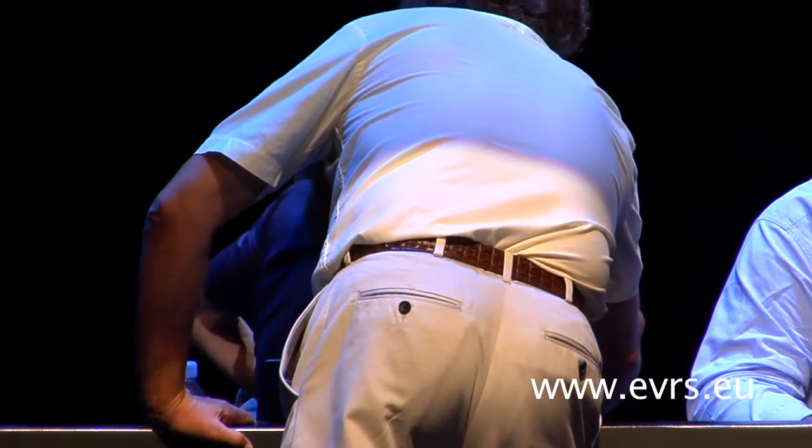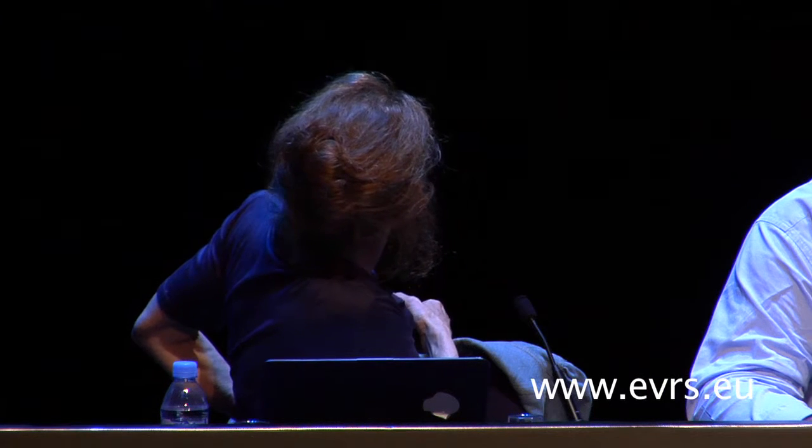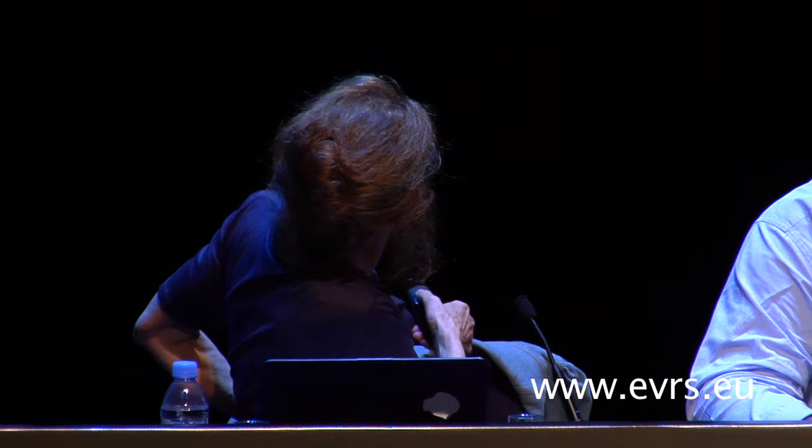Okay. Good afternoon. You know the principle of the flow control vitrectomy, which is that the pump self-adapts the vacuum to generate a constant flow independently of the variations of viscosity. For the sake of the understanding from many previous meetings, people told me that with the overlay on the screen of the console, it's a fantastic way to understand how it works.